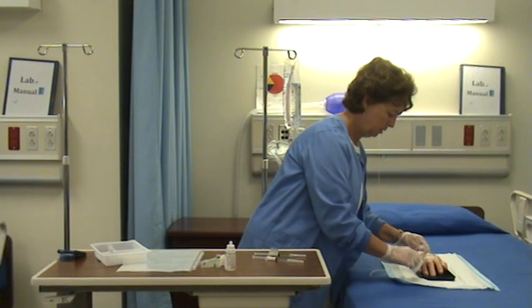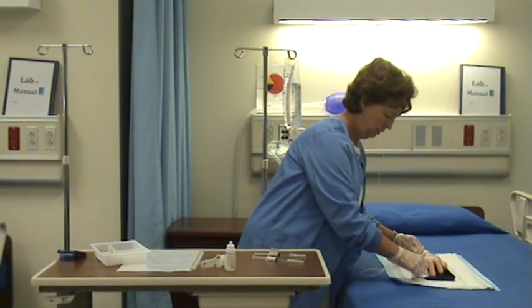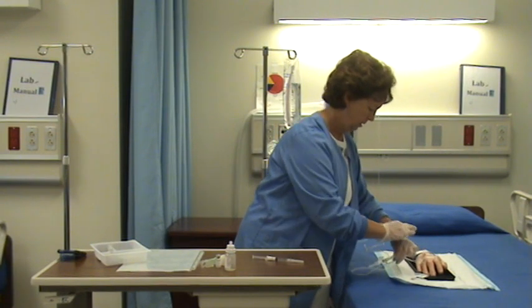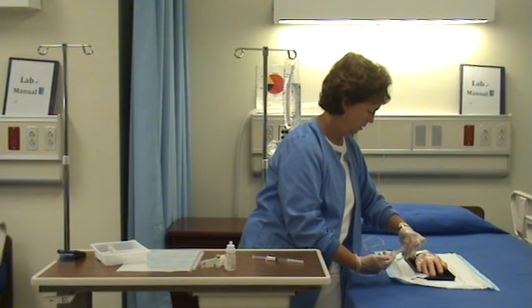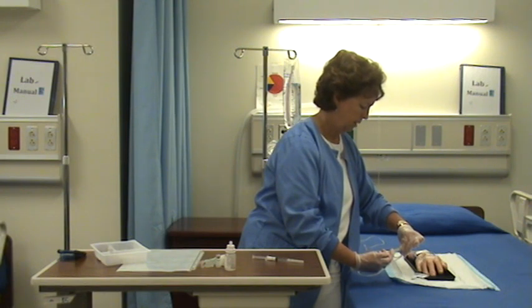Clean off the port. Got my Lasix. And the first 15 seconds, I'm going to inject approximately 1/4 of the medication.